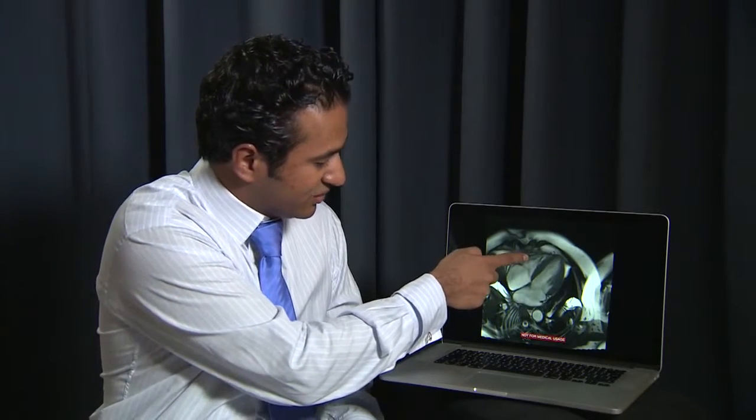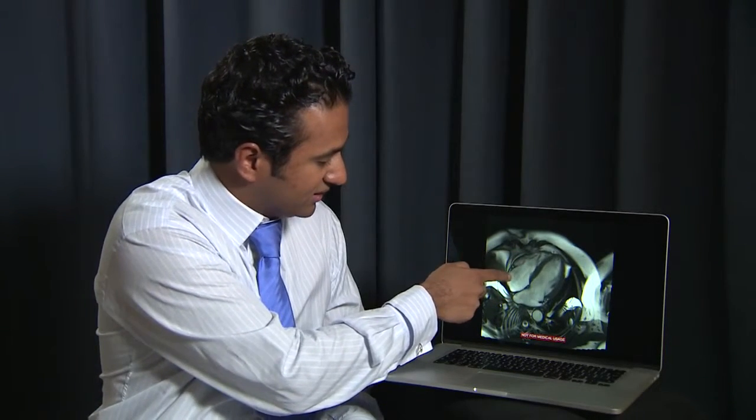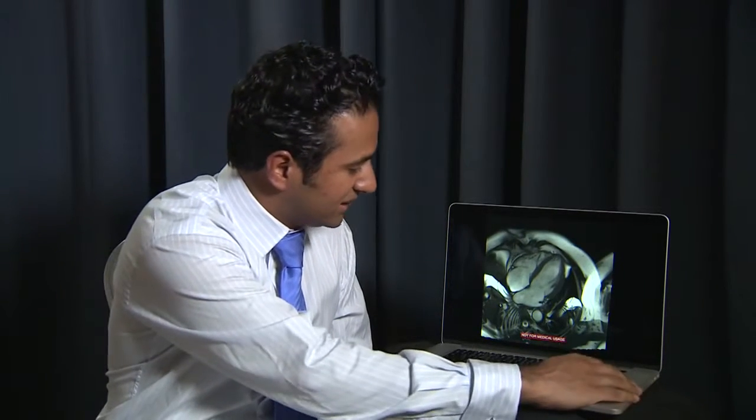Here are some examples of a cardiac MRI examination. You can see some beautiful pictures of the heart, and the resolution we have here is unparalleled to any other investigation. This is a four-chamber view, so here we can see the left ventricle, the left atrium, the right ventricle, and the right atrium. We can see how well the heart is pumping and beating.